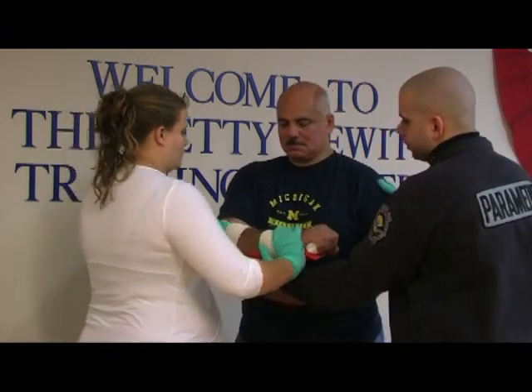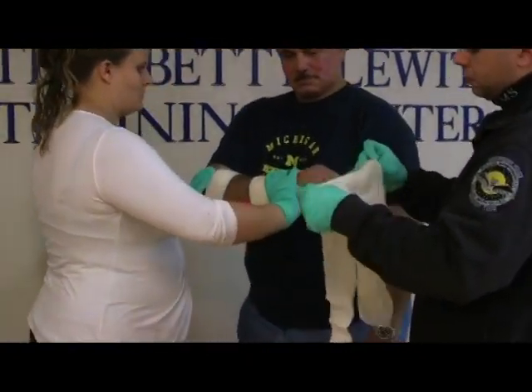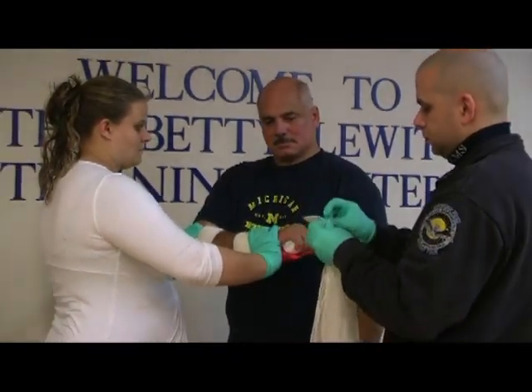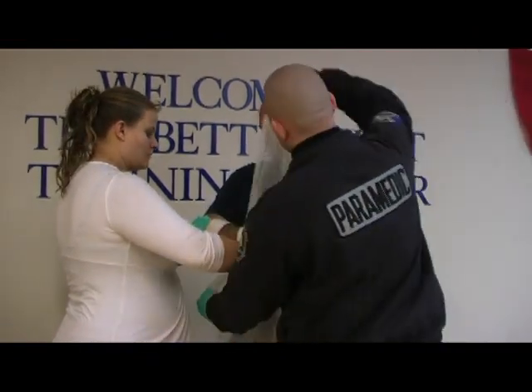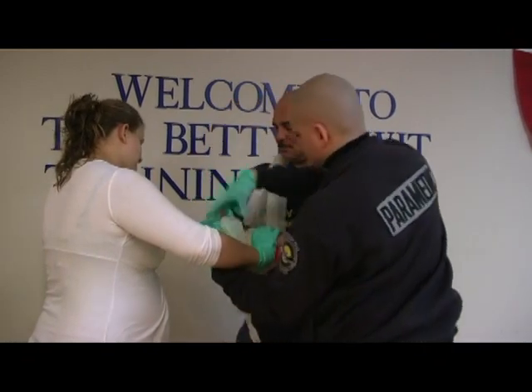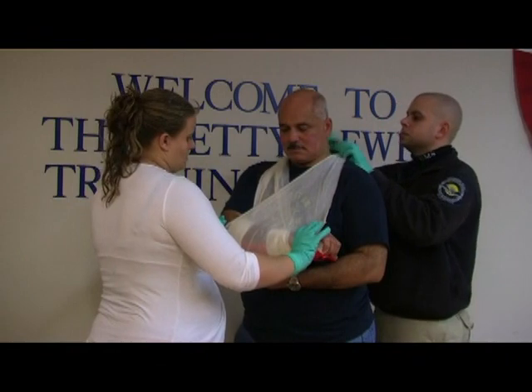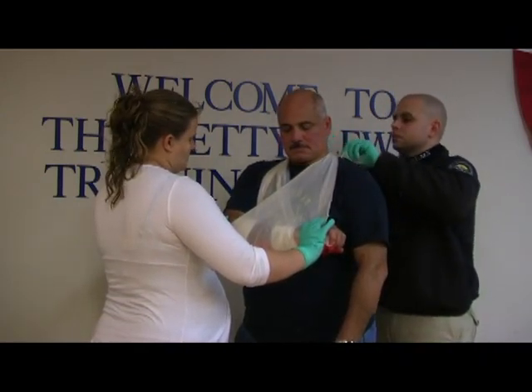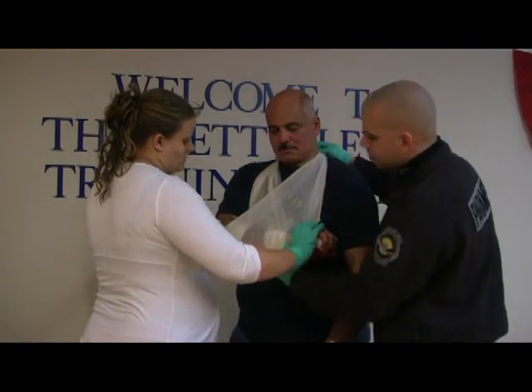Next, I'm going to have my partner bring the injured extremity to the patient's body. Next, I'm going to prepare my sling. Next, I'm going to apply my sling. Thank you.